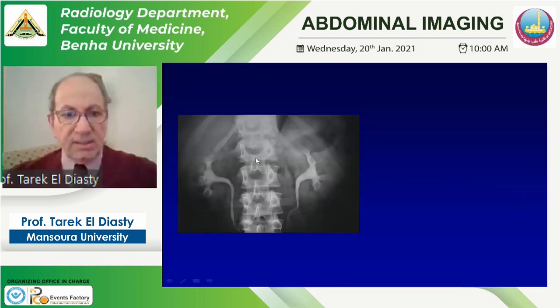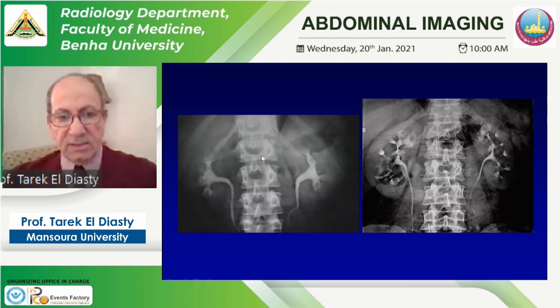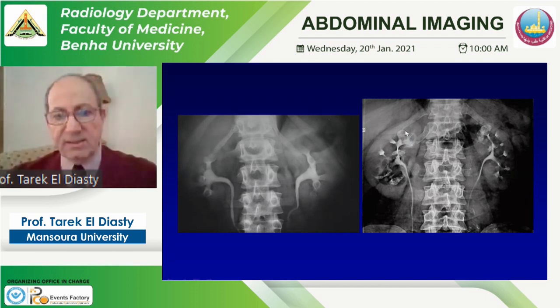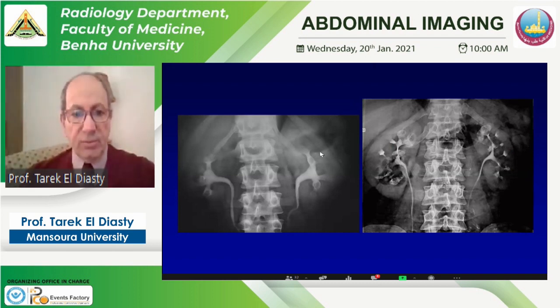This is a normal intravenous urography. Previously, before the developments of the new urographic techniques, it was the basic imaging study in the urogenital urologic system. Here we can see in this abnormal IVU that there is enlargement of the upper caliceal group. The papillae is enlarged with tubular ectasia — filling of dilated tubules with contrast bilaterally — in a case of medullary sponge kidney, in comparison to the normal medulla on the normal IVU.